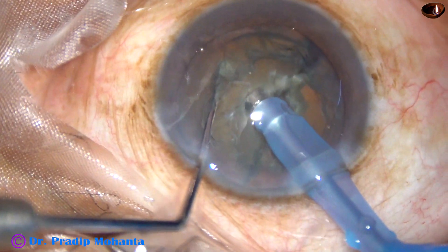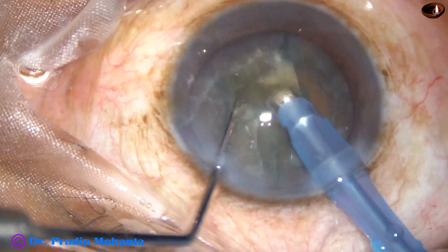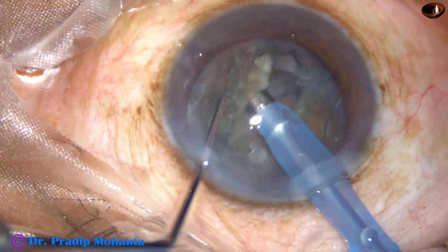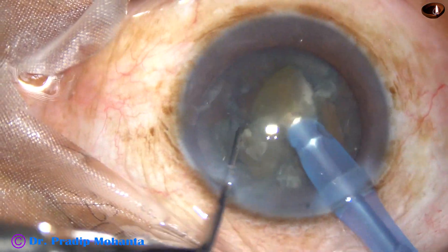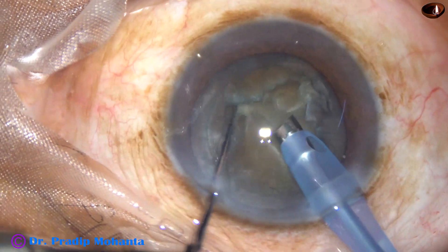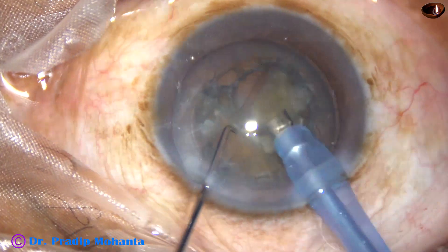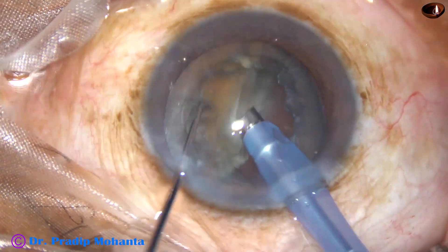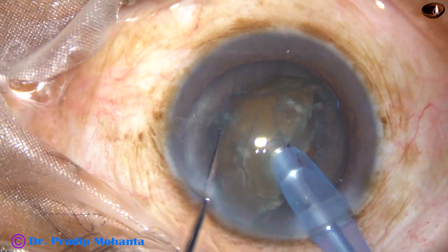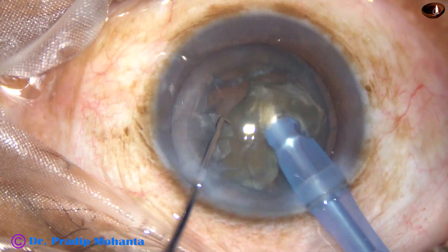Thus the tip gets occluded very nicely — you can hold the nucleus very firmly and chop it into fragments. This is the key: you have to go into the substance, the tip should be completely occluded, and then you come back to aspiration mode using the foot switch to hold the nucleus very firmly.